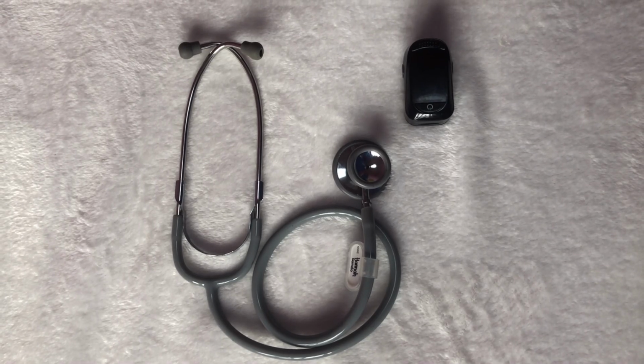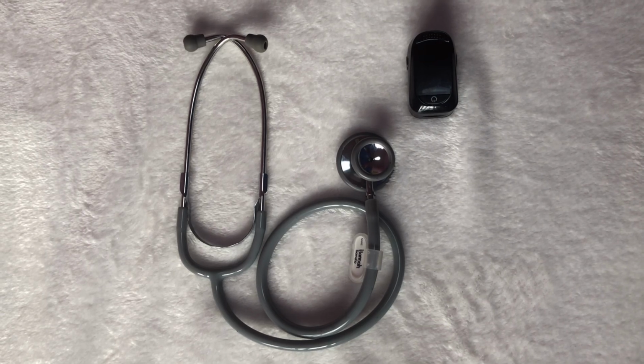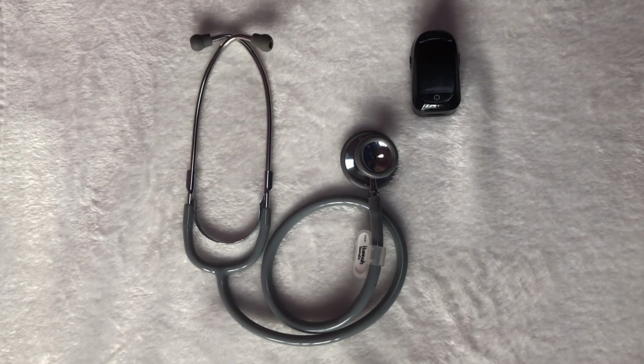It includes interpretation of vital signs, inspection of the patient's breathing pattern, skin color, and respiratory status, palpation to identify abnormalities, and auscultation of lung sounds using a stethoscope. Gather the supplies needed for the assessment, such as the stethoscope and the pulse oximeter.